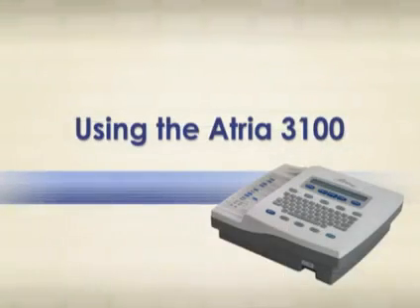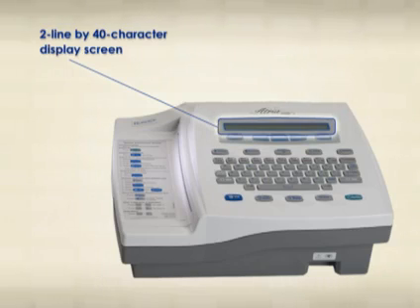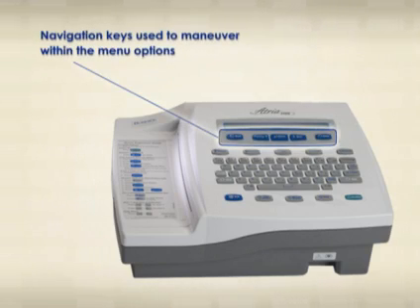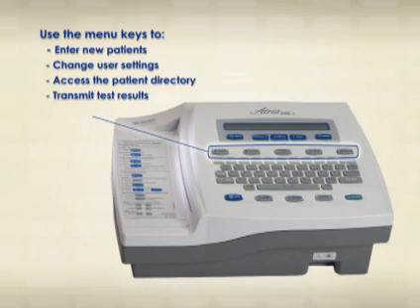Now, we'll go over the Atria 3100's interface, which is designed to be user-friendly. The 2-line by 40 character display screen at the top of the device clearly shows the various menu options. The blue keys below the display screen let you quickly navigate through the menu. The menu keys, located below the navigation keys, let you enter new patient information, change device settings, and access the patient directory, reports, and communication modes.